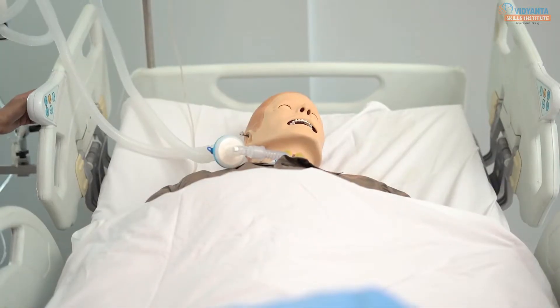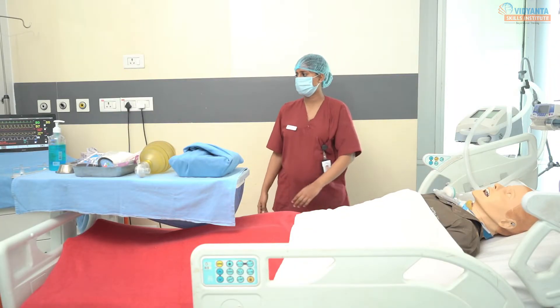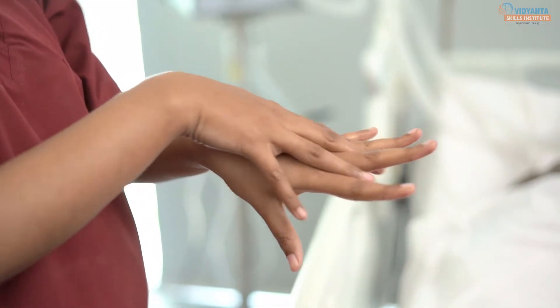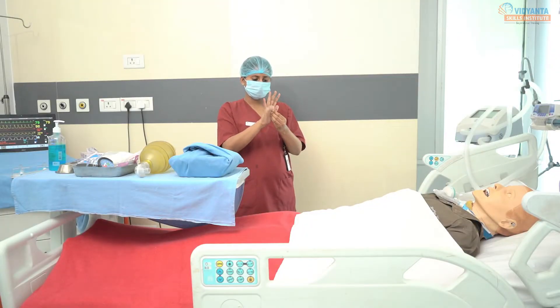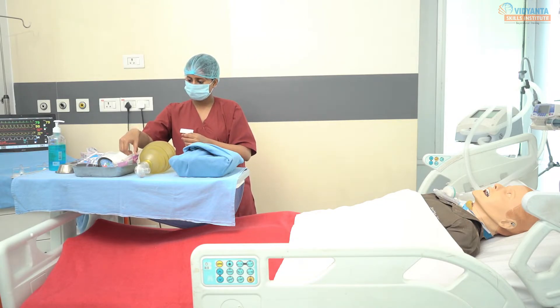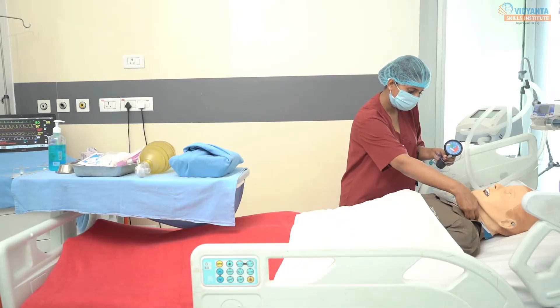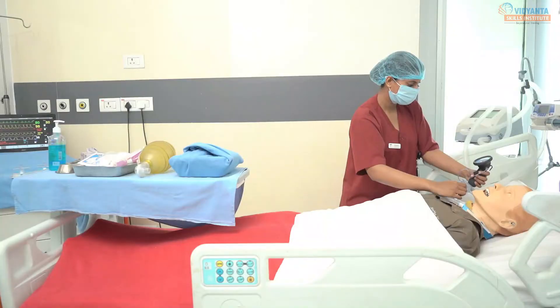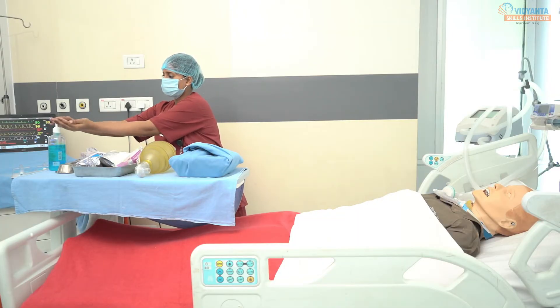Give semi-Fowler's position to the patient unless it is contraindicated. Perform hand hygiene. Check the tracheostomy tube cuff pressure with the help of a cuff pressure manometer. Normal cuff pressure is 20 to 32 cmH2O. Perform hand hygiene again.